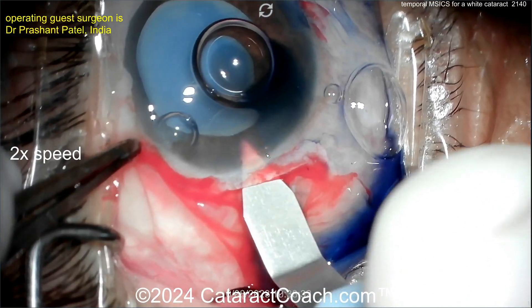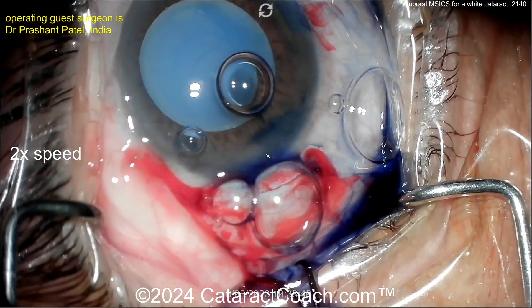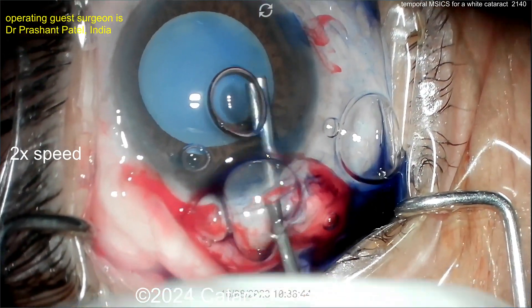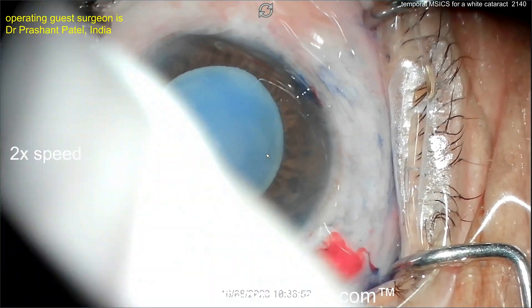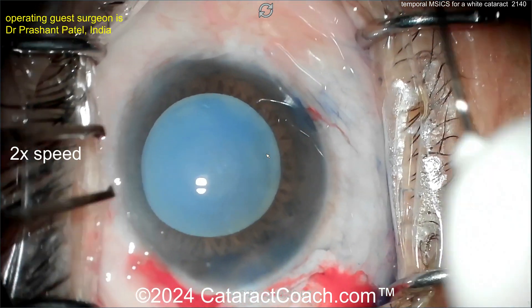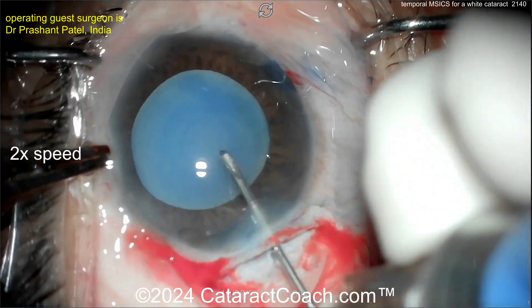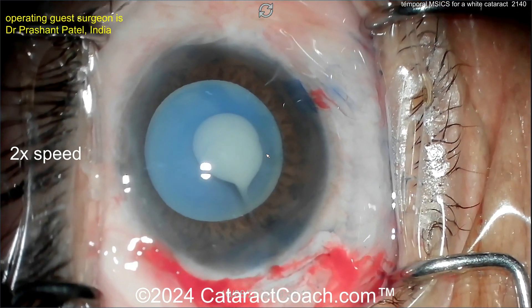Maybe make the capsule a little less elastic. Viscoelastic going inside the eye — very nicely done. Now here's the keratome entering inside, widening up right from the start. Sometimes I like to just enter narrowly with the keratome and then do the capsulorhexis — I find it a little easier. But you can certainly do the wide incision right off the bat too; it's a little tougher to control the capsulorhexis that way. Now going in with the cystotome — look at the milky, intumescent lens for sure.